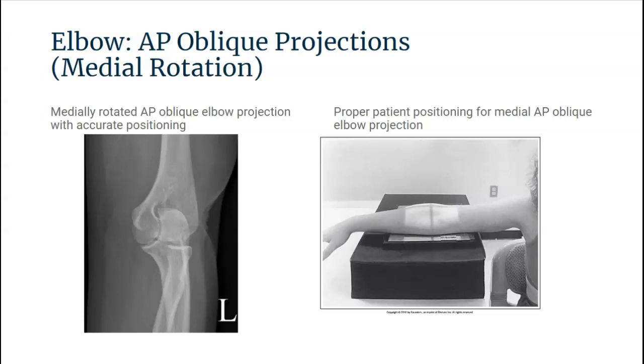The elbow joint, 1/4 of the proximal forearm, distal humerus, and lateral soft tissue are all to be included within the exposure field.